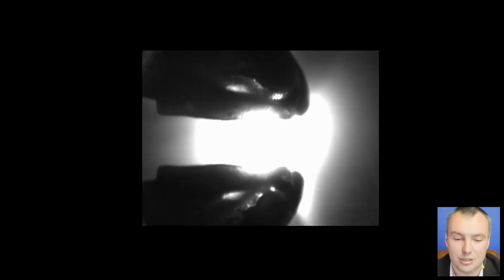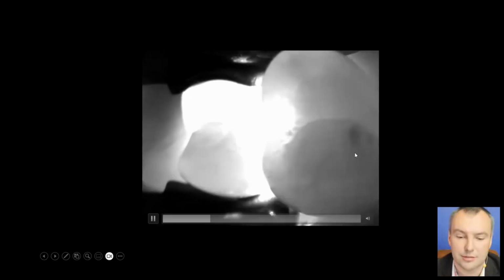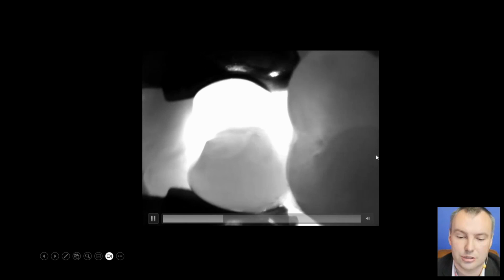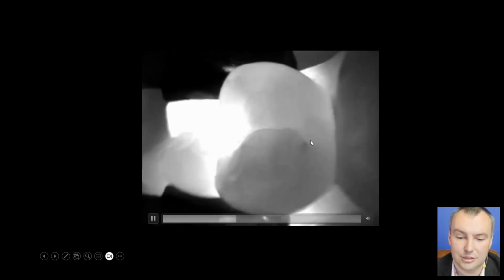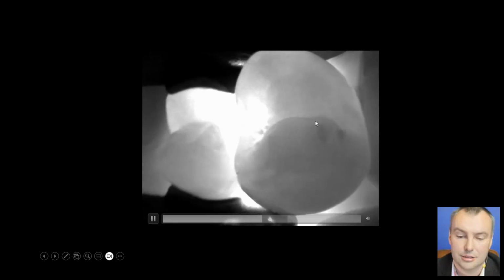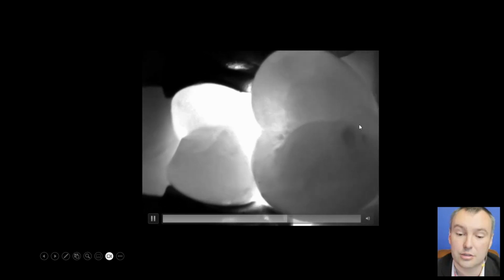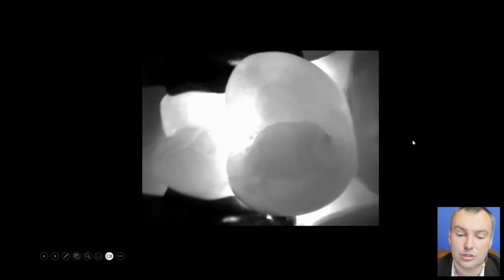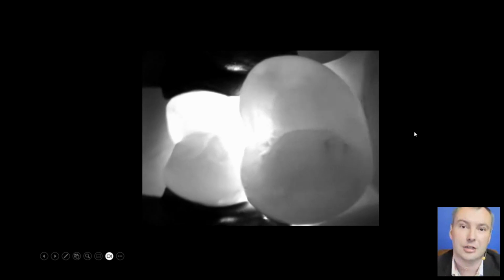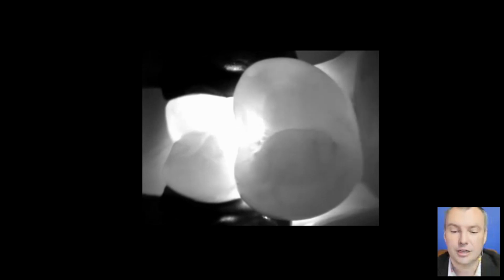And with the DiagnoCam, we found a very small, not quite visible cavity. Look here. This is the entrance, a very, very small one, and demineralization around here. Well, not so small, actually. This is very often the case, especially nowadays, with a lot of fluoride intake and quite good hygiene: small damage in the enamel, and bigger caries in the dentin.